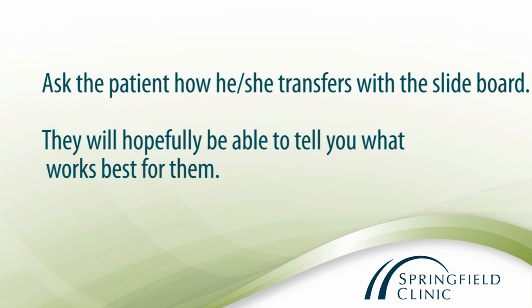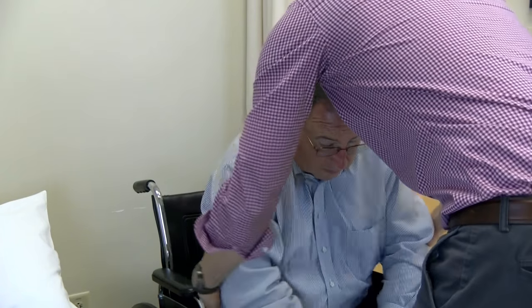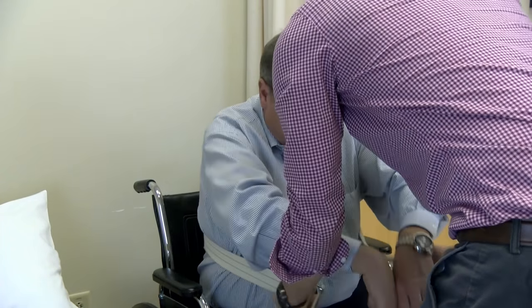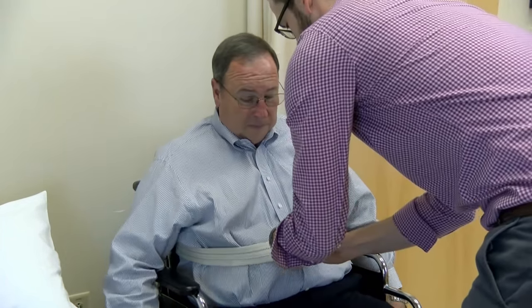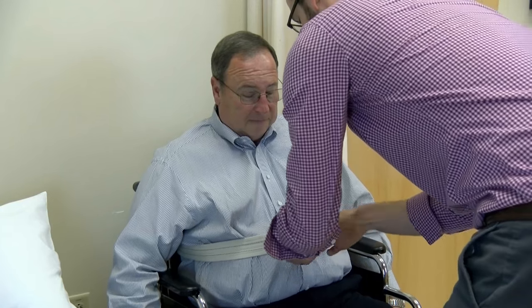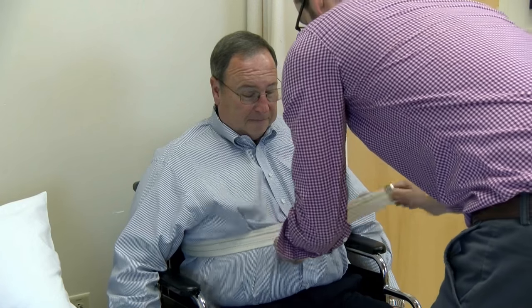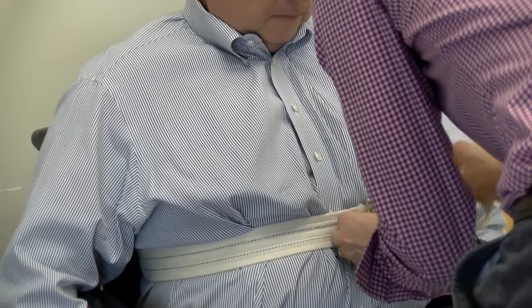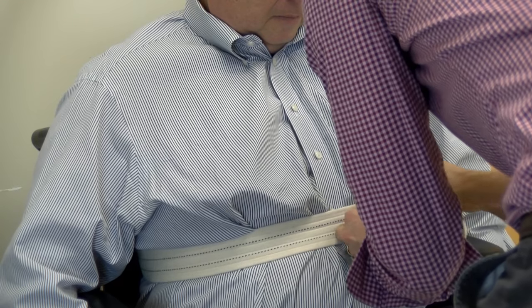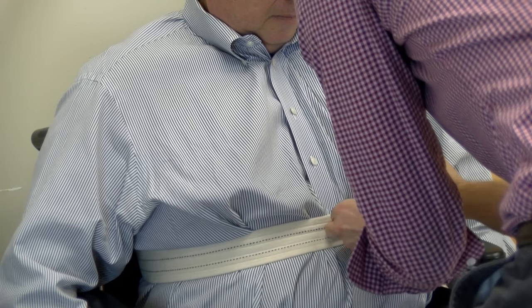Ask the patient how he or she usually transfers with the slide board. They will hopefully be able to tell you what works best for them. For your safety and the safety of the patient, always use a gait belt. The belt should be placed low around the patient's stomach at about the height of the belly button.